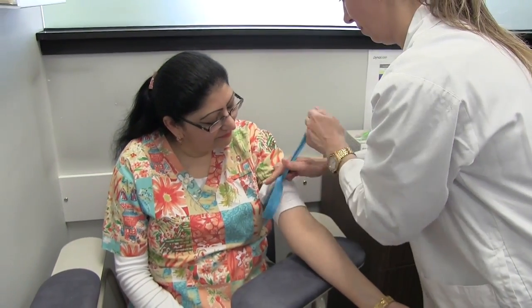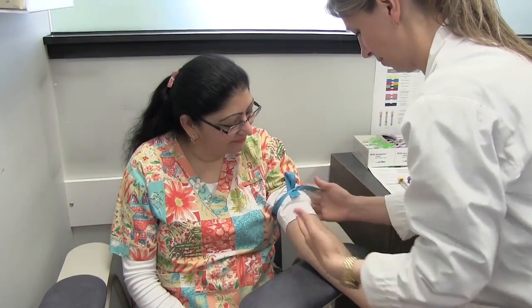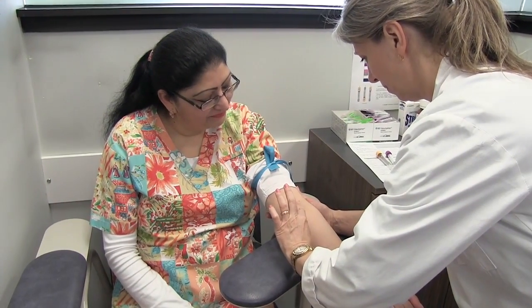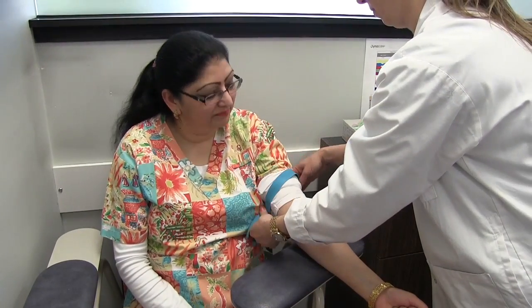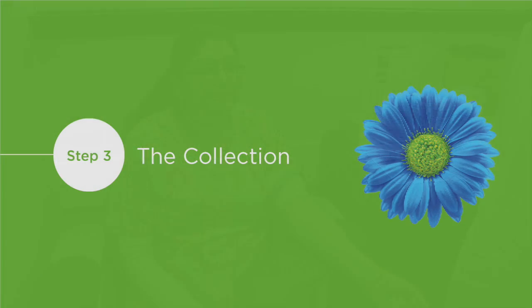Apply the tourniquet three to four inches above the draw site and over the clothing if possible. Ask your patient to clench their fist without pumping it, check for an acceptable vein, and then remove the tourniquet.